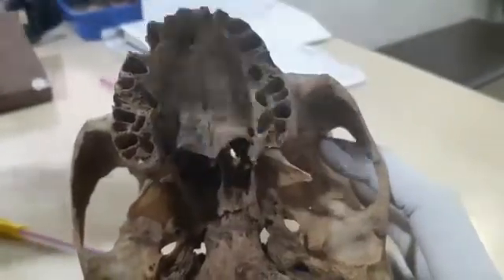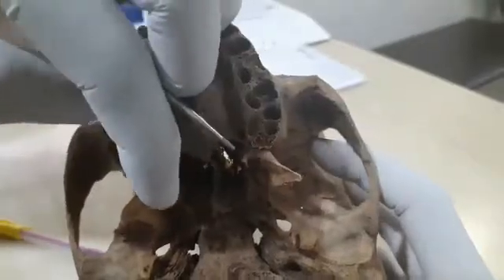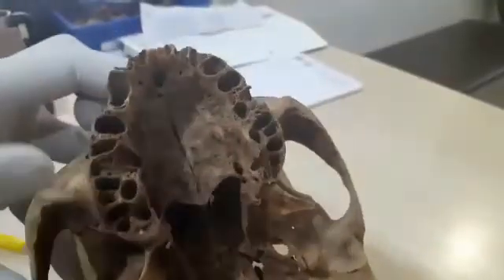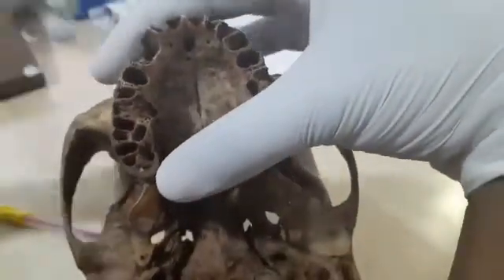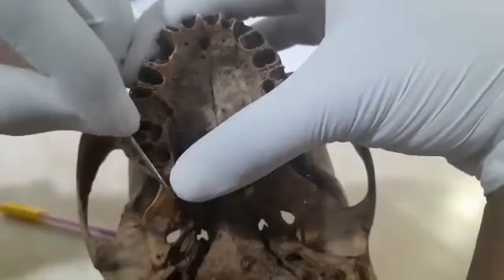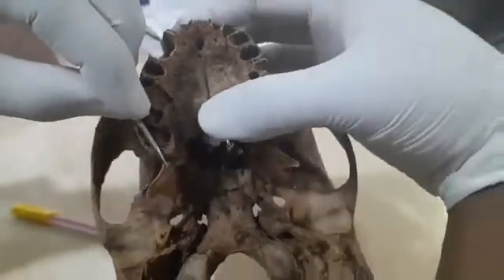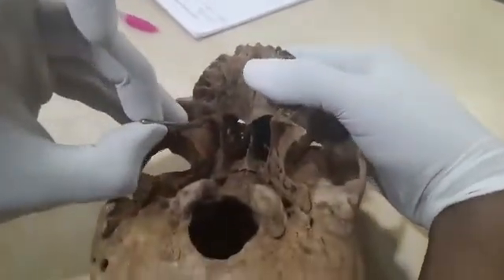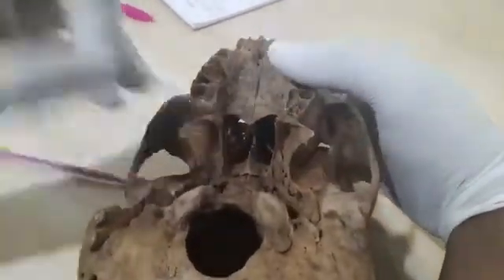For that, you need to first palpate this medial hamulus. You can palpate this in patients. You can place one finger here, like this, in patients. Now you start drilling like this and you enter here. This is the target area. So your drill should enter like this.